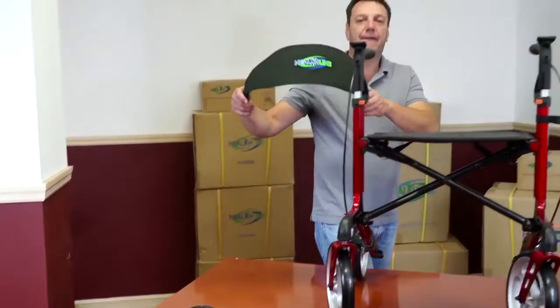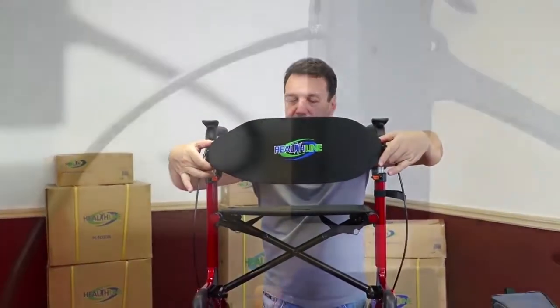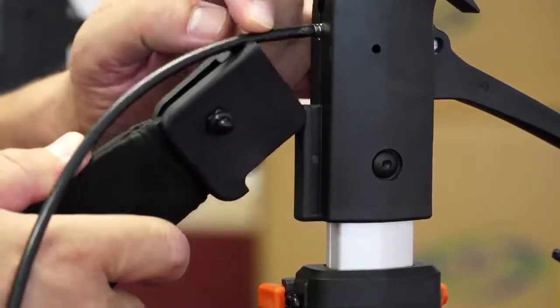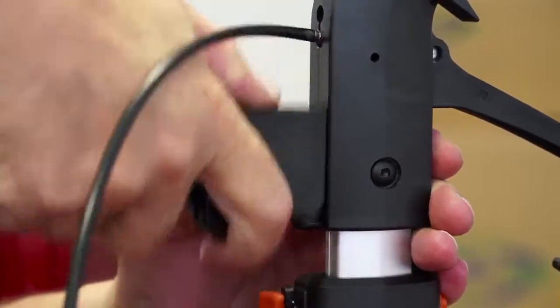Attaching the back support. Bring the back support to the front of the rollator with the logo facing out. Slide the plastic tips into the corresponding plastic grooves on both sides of the frame.